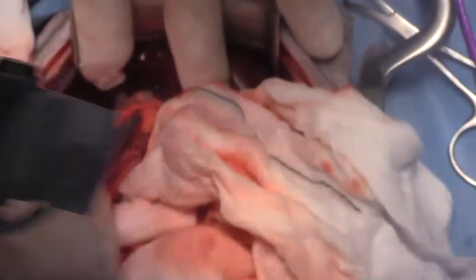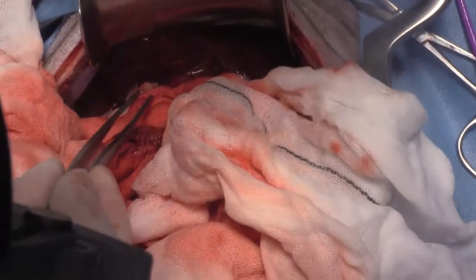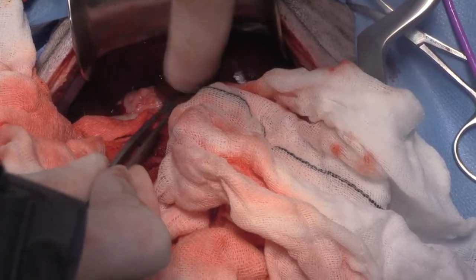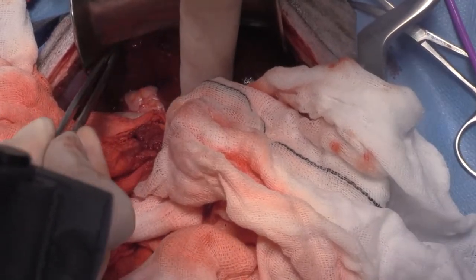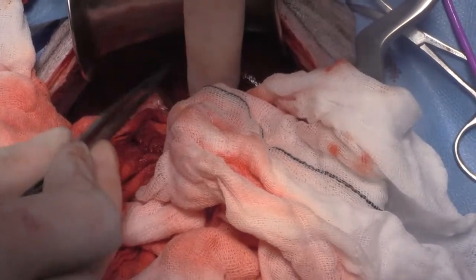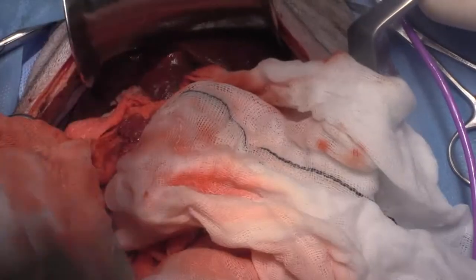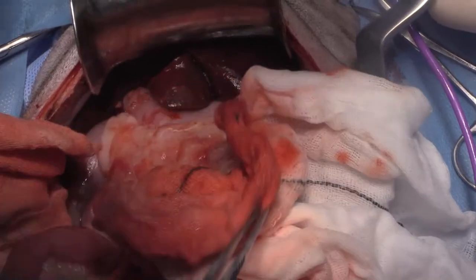I'm just having a bit of a look down here to make sure there's no traumatic bleeding or concern. So if we hold that up there, Jeff, we might be able to just make out in there. This is the area, right in the middle in the quadrate lobe, that the gallbladder has been sitting in, and that's where we removed it from. It's kind of tucked up under the ribs there, so it's a bit hard to see on the video. So that's all pretty good.